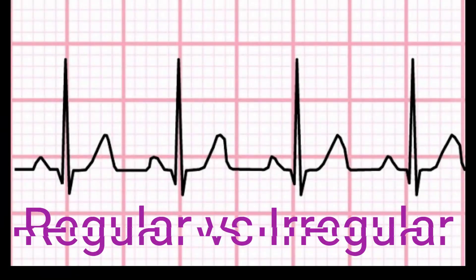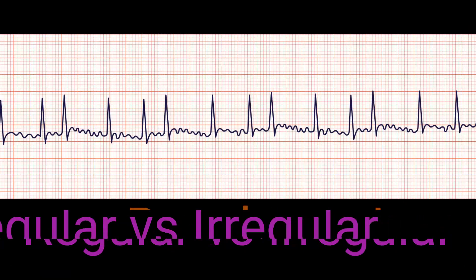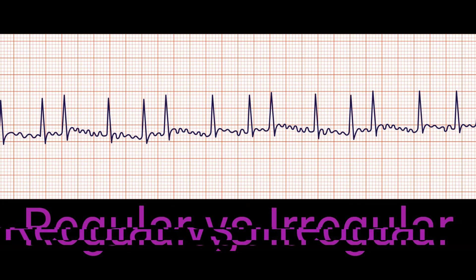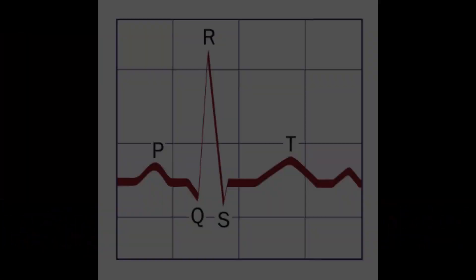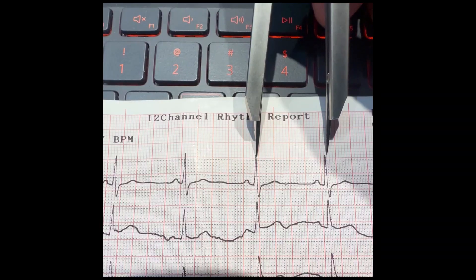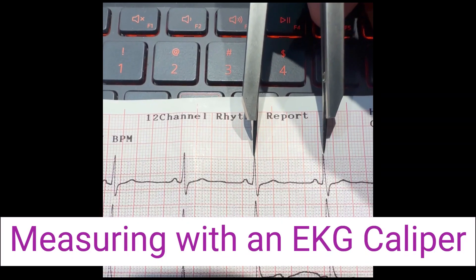This video will show the basic method of determining the regularity of an ECG or EKG rhythm. An EKG rhythm is considered regular if the time intervals between consecutive QRS complexes are consistent.